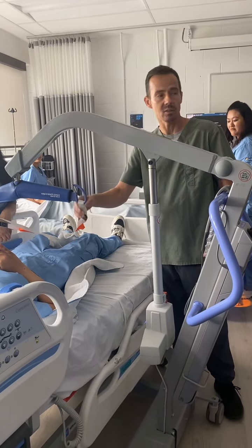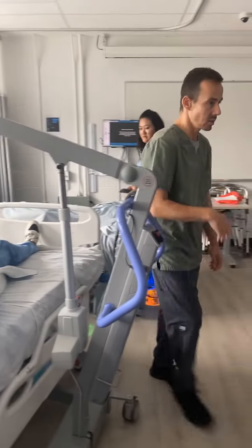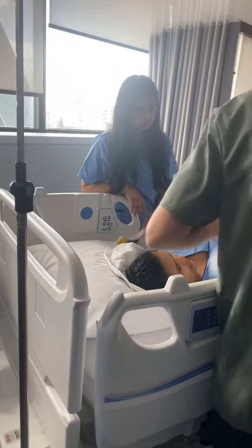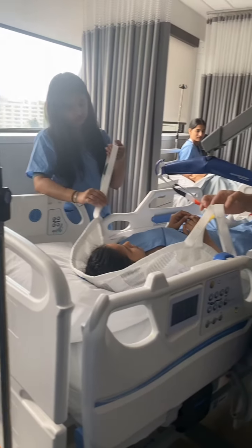So bottom parts are usually hooked up with the longest hooks, and then in order to get the patient into kind of a sitting position, you want to use the shortest ones for the top.